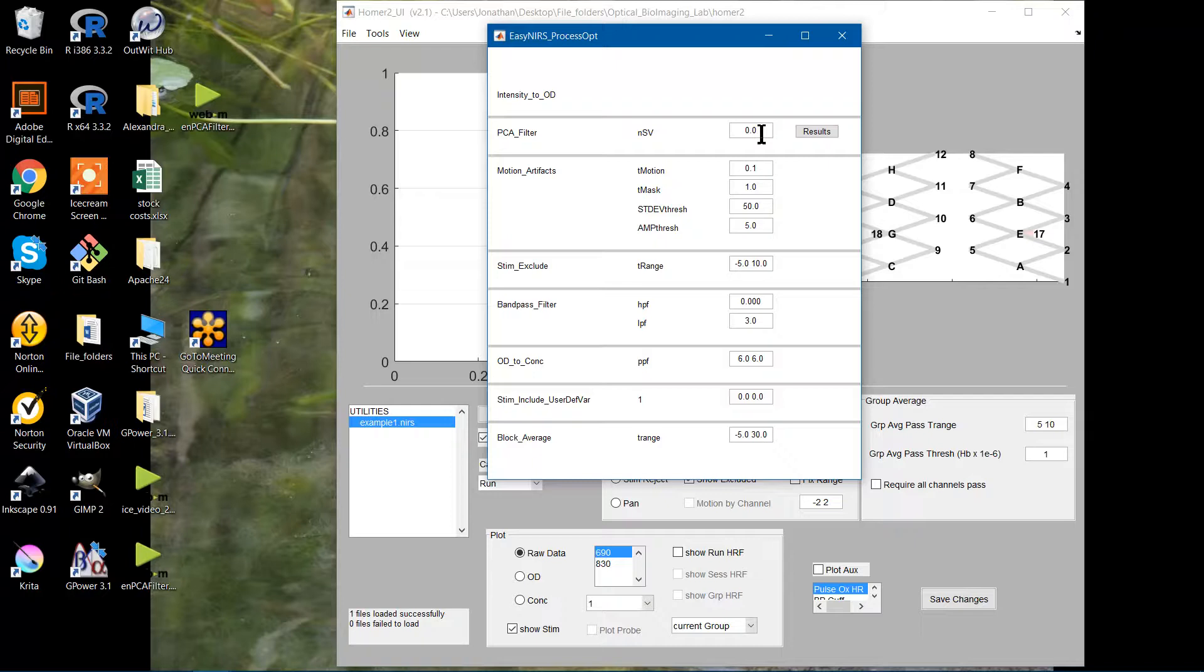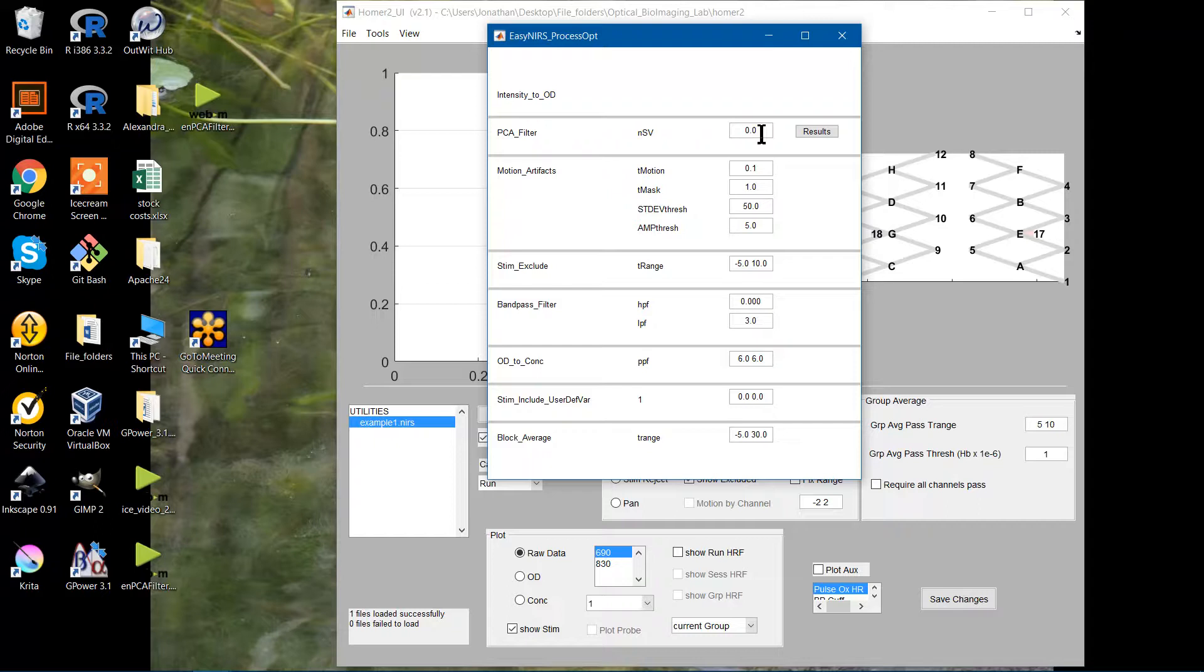If I put in two separate numbers, I will say 1 and 2. For wavelength 1, I will remove one component. For wavelength 2, I will remove two components. So it actually acts on each wavelength separately if you do two integers.